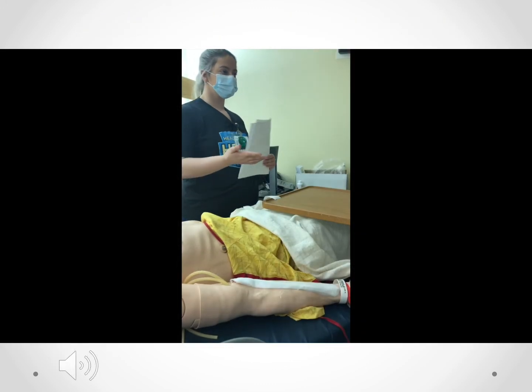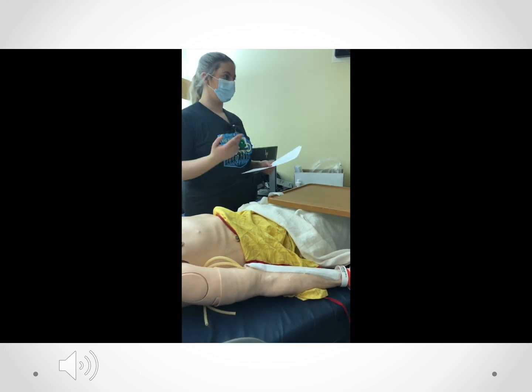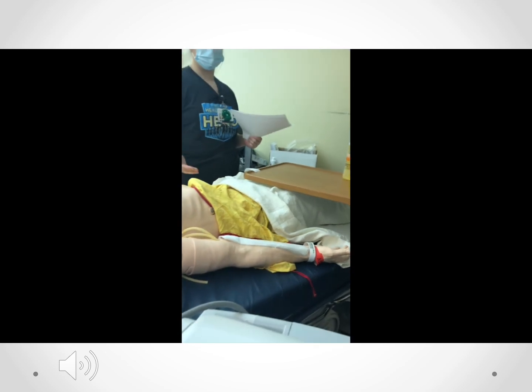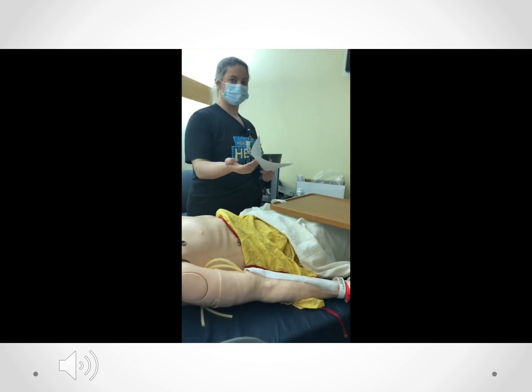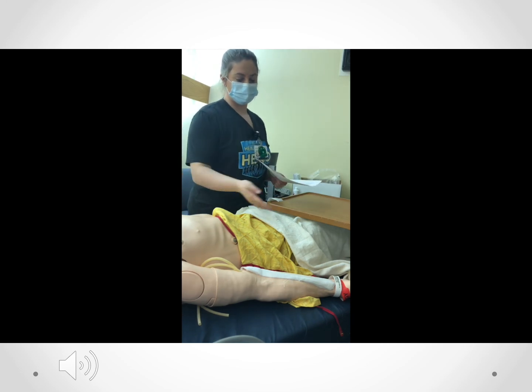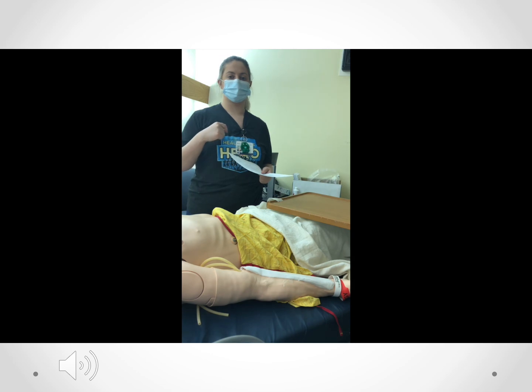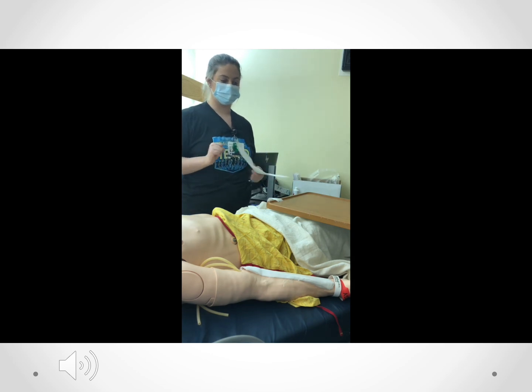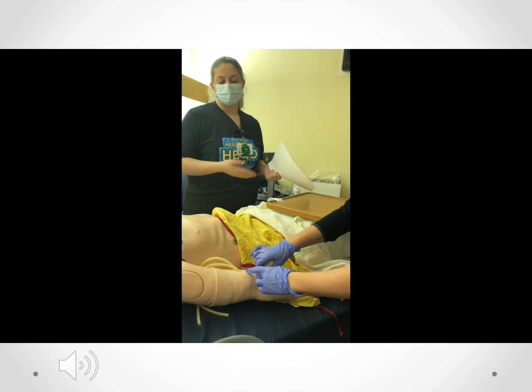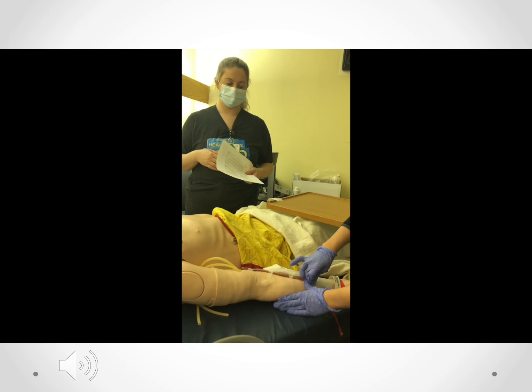I'm Liz, this is Katie, and we're going to show you how to care for a radial artery harvest site. So with the radial artery harvest site, you'll see that the dressing will be applied in the OR, and it's just a dry gauze and a tegaderm over the top. Underneath you'll see that there are steri strips as well over the site. So 24 hours after surgery, you can take the dressing off, as Katie is doing.